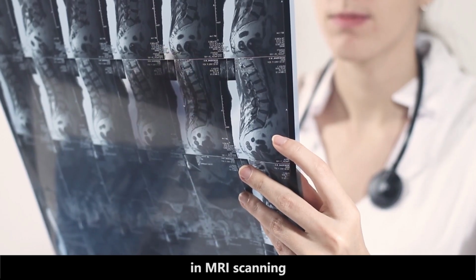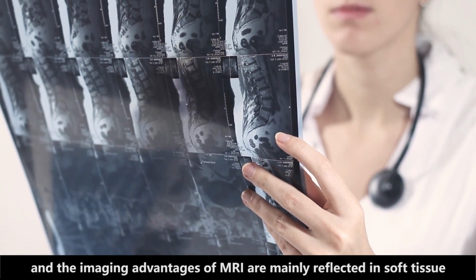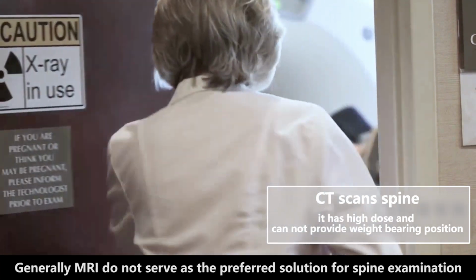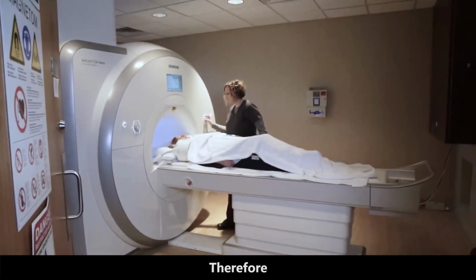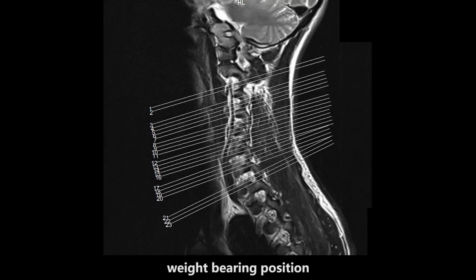Similarly, MRI scanning also faces weight-bearing position measurement problems. The imaging advantages of MRI are mainly reflected in soft tissue. There are relatively many contraindications and long scanning time. Generally, MRI does not serve as the preferred solution for spine examination. Therefore, there is currently no diagnostic and information solution for the clinically urgent need of three-dimensional spine scanning under the standing, weight-bearing position.